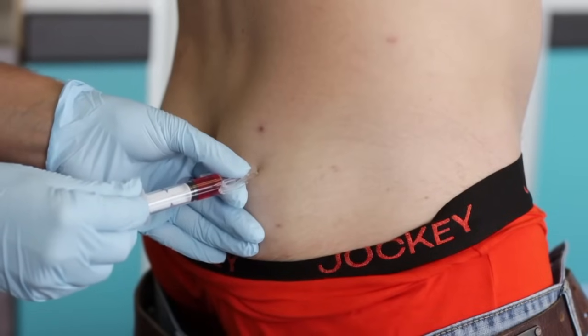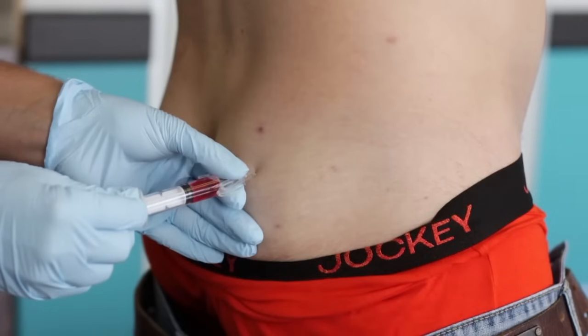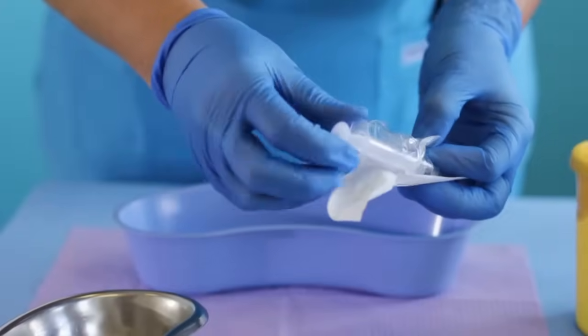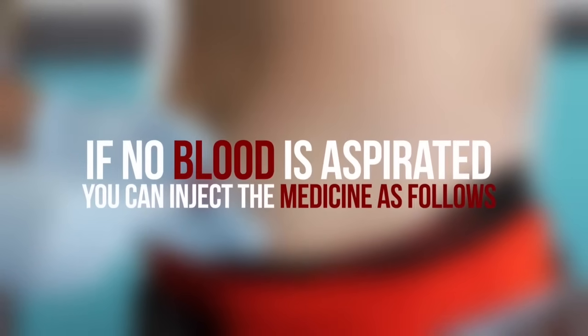It is essential to aspirate before depositing the medication into the muscle. To do this, gently withdraw the plunger before the injection in order to avoid an inadvertent intravascular injection and thus a possible medical emergency. If you aspirate blood, withdraw the needle and prepare a new syringe. If no blood is aspirated, you can inject the medicine as follows.